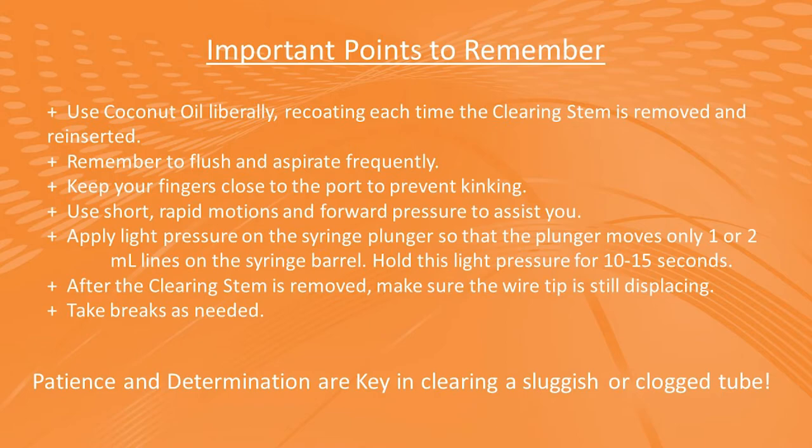Let's review the important tips and tricks covered today. Use coconut oil liberally and recoat the stem each time you remove and reinsert. Flush and aspirate frequently. Keep your fingers close to the port and avoid other motions that might cause kinking. Use short rapid motions and forward pressure to your advantage. Hold 10 to 15 seconds of pressure on the enteral syringe to help move the clog through the tube. In between removing and reinserting the Clearing Stem, always check that the wire tip is still displacing correctly. And always take breaks as needed.